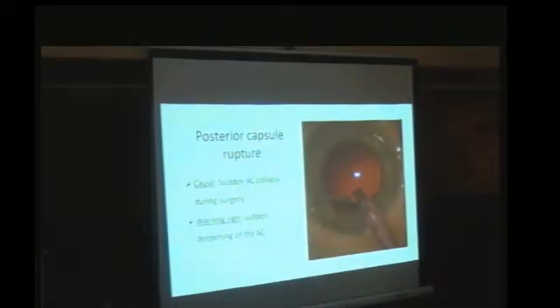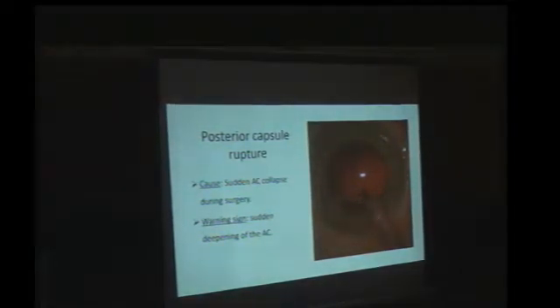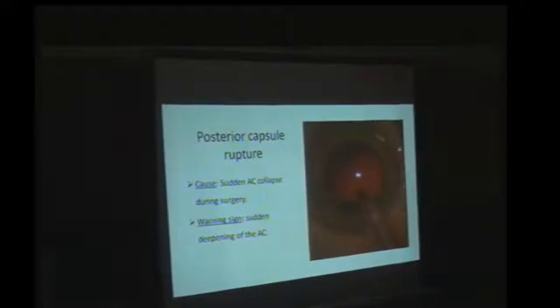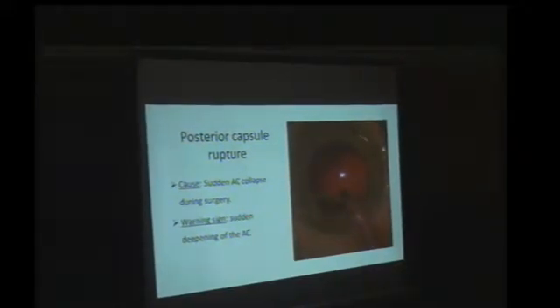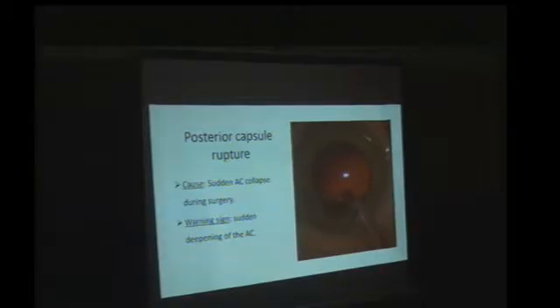رابشر بوستيريور كبسول ده ليه ورنينج ساين. لو انت شغال وحصل معاك كولابس في الانتيريور تشامبر او حصل بوست اوكلوجن سيرج، ده غالبا هو اللي بيؤدي الى رابشر بوستيريور كبسول. فتلاقي بعد ما حصل سيرج او كولابس انتيريور تشامبر تلاقي مره واحده حصل ايه؟ سادن ديبنينج اوف انتيريور تشامبر. ساعتها تبص بقى وتدور غالبا هتشوف ايه الاوبننج اللي حصل في البوستيريور كبسول.